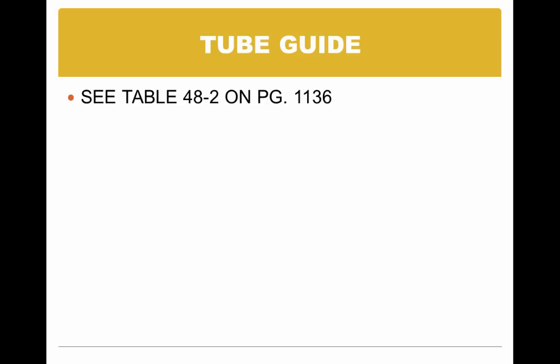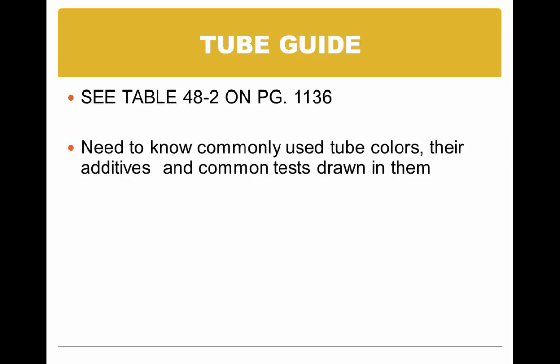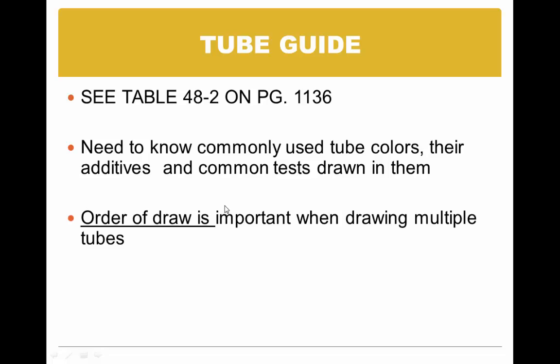See table 48.2 on page 1136 for your tube guide. You need to know commonly used tube colors, their additives, and common tests drawn in them. The order of draw is important when drawing multiple tubes. Okay, we talked about that the other day because you can have some of the additives left on the needle that goes into the tubes.